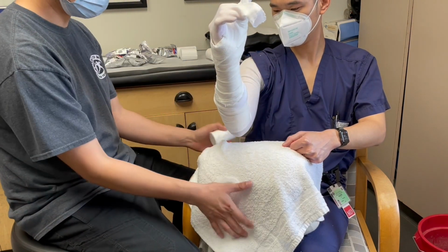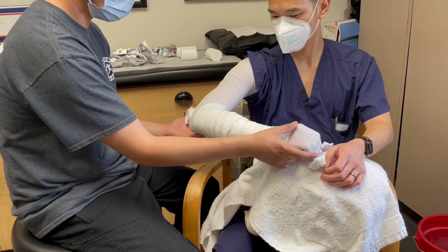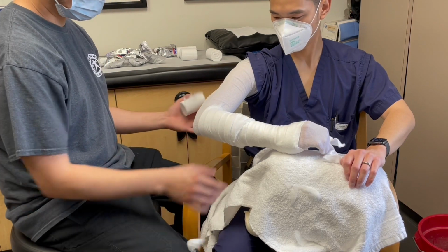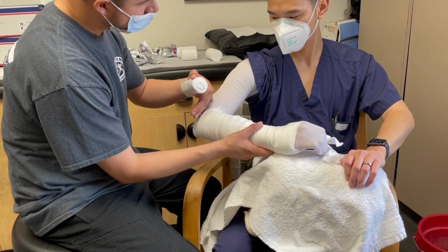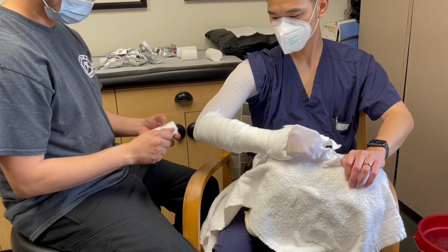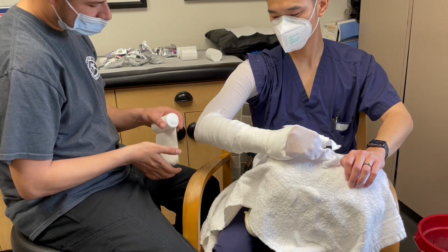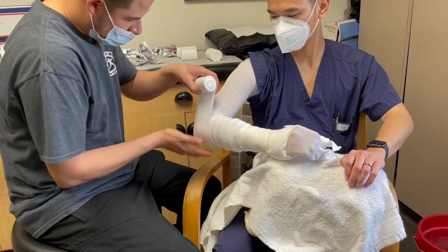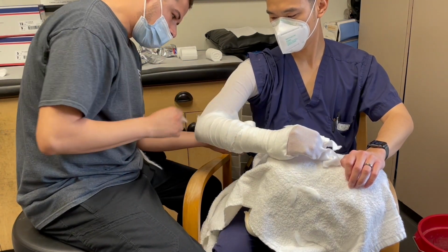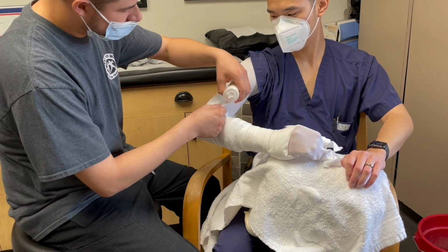As we pad down towards the elbow, you have them rotate the arm like this while maintaining the 90 degrees of flexion at the elbow. As we pad the elbow, we can make little tears here to help the padding lay down a little more flat.